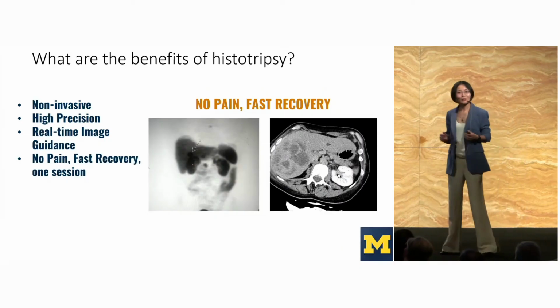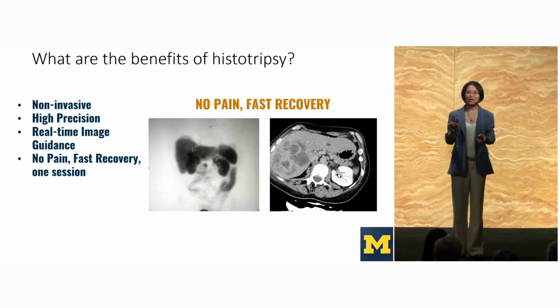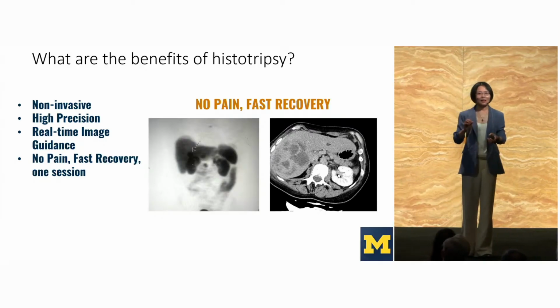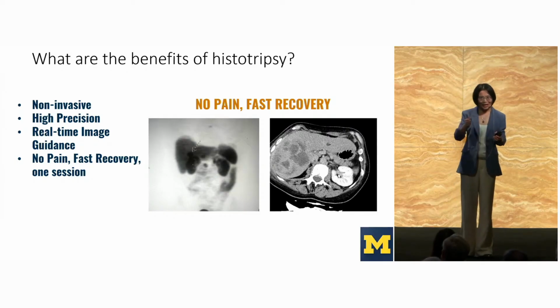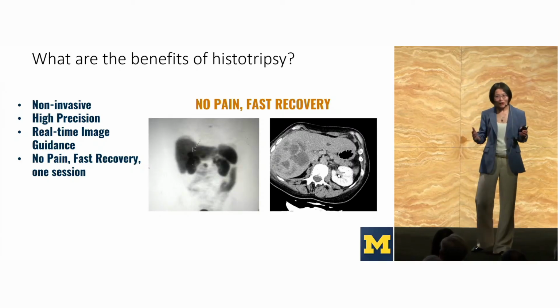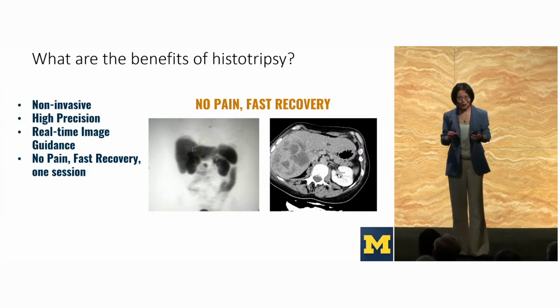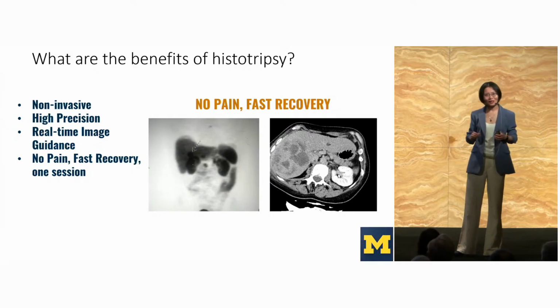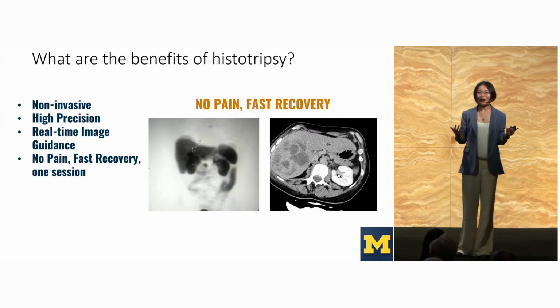Next, most patients wake up from the histotripsy procedure, by the way, it's a one-session treatment. The patient comes in, and the clinicians put them down, scan, and remove the tumor. Depending on the size of the tumor, within a couple of hours they wake up, and our record right now is 10 tumors treated in one session. But typically, patients wake up, and the first thing they ask is, have you done anything to me? Because they don't feel any pain.